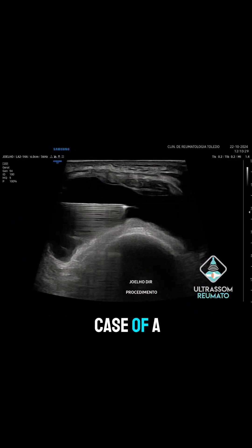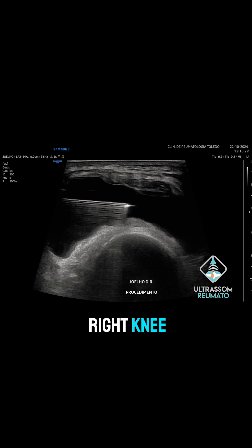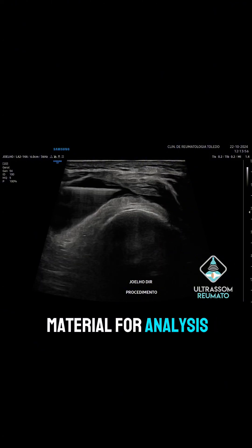We present the case of a 49-year-old male patient with a large joint effusion in the right knee following trauma that occurred three months ago. We performed an arthrocentesis, a procedure for drainage and collection of material for analysis and culture.